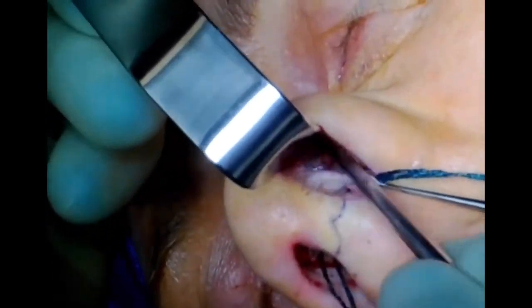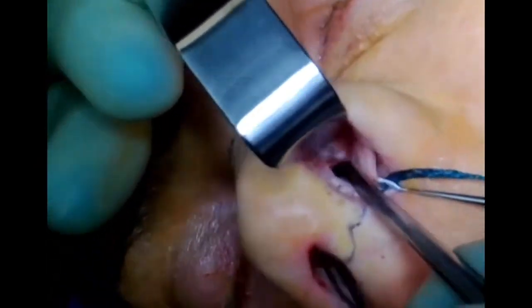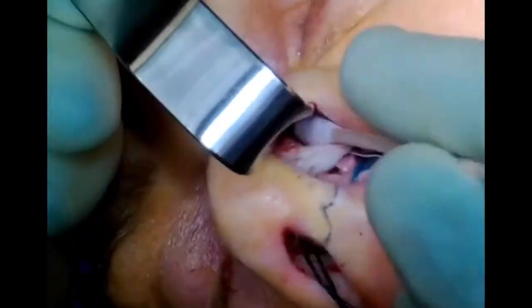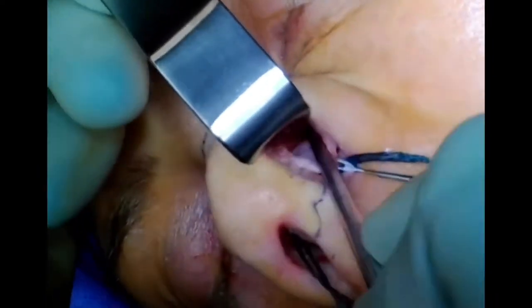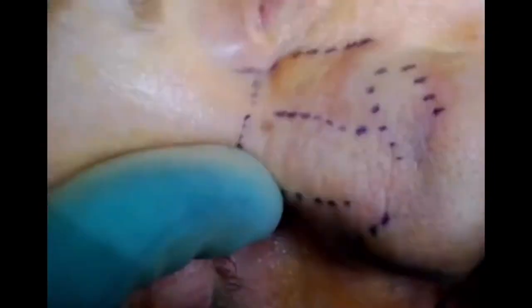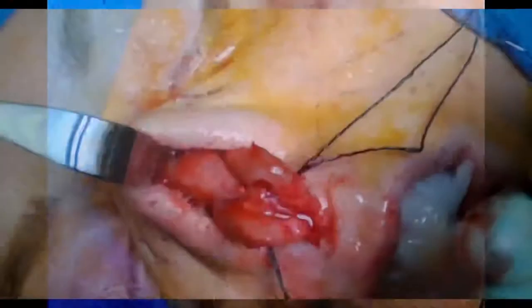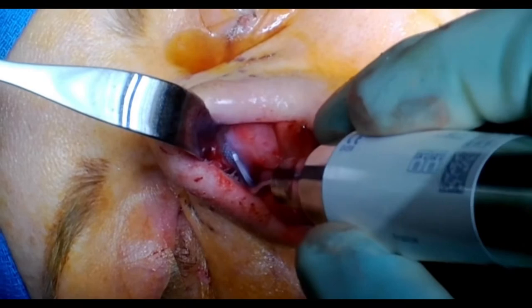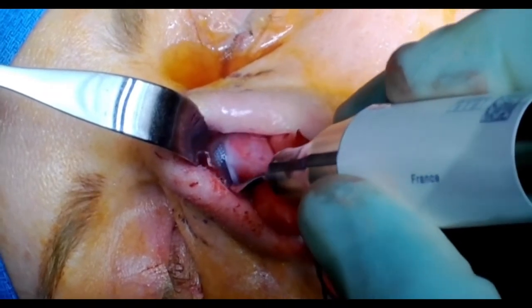If it's bleeding, you're in the wrong place. As soon as you can feel the edge of the nasal bone, the easiest thing to do is just take a knife and incise the periosteum. Once you've got the periosteum incised, with the caudal elevator you can find the subperiosteal plane. If you're in the right place, it elevates quite easily and bloodless. Here we are dissecting all the way up to the nasal sidewall and medial canthus, out onto the maxilla a little bit and then up to the nasal dorsum. We've completed the opening process. I've made the transcolumellar incision and we've dissected the dorsum in a subperichondrial and a subperiosteal plane.